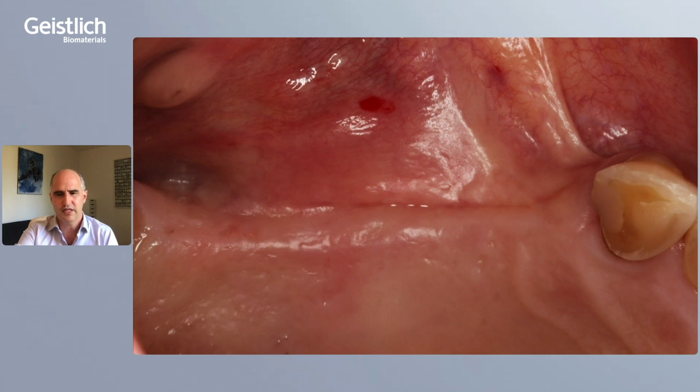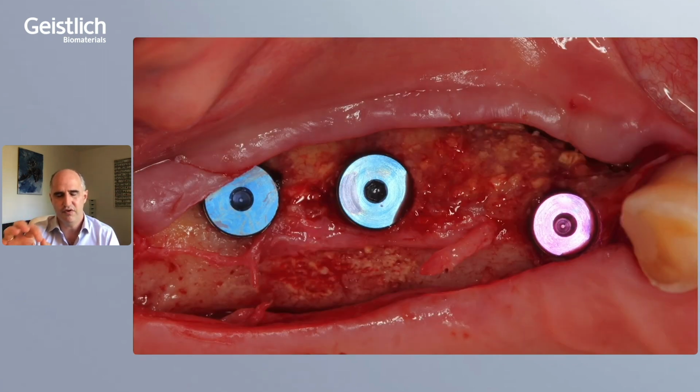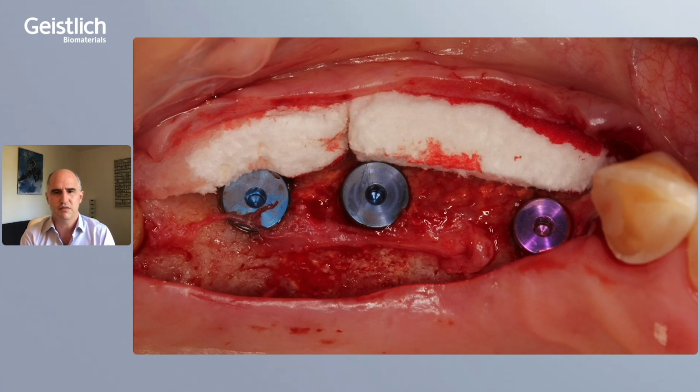So here's a clinical situation at the time of implant placement, a situation after bone augmentation. So I'm ready to place my implants, but as I see, there is a very, very small amount of soft tissue height and thickness. So look at the flaps. It's 1.5 millimeter thick, and I have a clinical situation where I really want to have a nice and thick soft tissue apparatus in this context. I have enough bone, so what I do is I use some soft tissue management to prepare myself for the second stage surgery, where I want to play with the increased soft tissue.